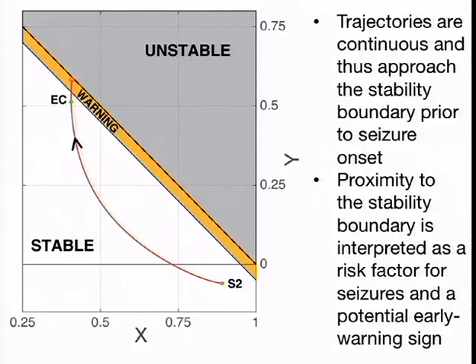We've done some work of coupling our model of the ascending arousal system, in terms of sleep, to drive those changes in the connection strengths, but there is a lot more work to be done in terms of associating those connection strengths with particular mechanisms such that we could identify or predict in a sort of Kalman filter-esque way what's going to happen next in the system, beyond what we're able to do at present, which is to look at the collection of subjects that we have and then infer the types of changes that we see in brain state based on what we have in the experimental data.